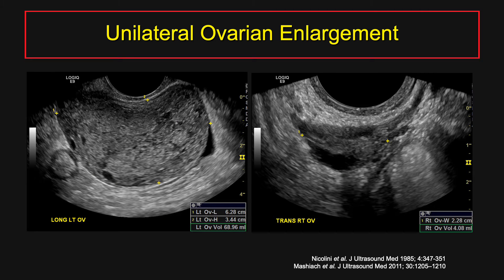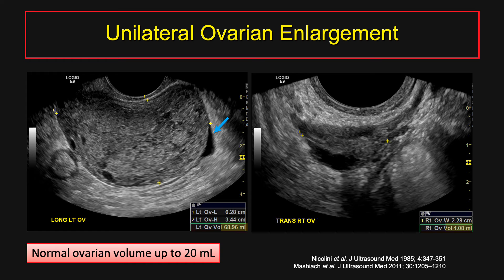Let's look at some of the morphologic findings of ovarian torsion, beginning with a common finding: unilateral ovarian enlargement. This is a case of a 20-year-old woman with left ovarian torsion proven at surgery. You'll notice marked asymmetric enlargement of the left ovary, which is edematous with a small amount of free fluid adjacent to it, compared to the normal-sized right ovary. The left ovary measures about 70 ml and the right 4 ml. The average volume in a premenopausal woman is about 10 ml, but can range up to 20 ml within normal limits.